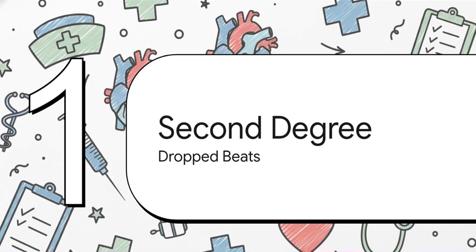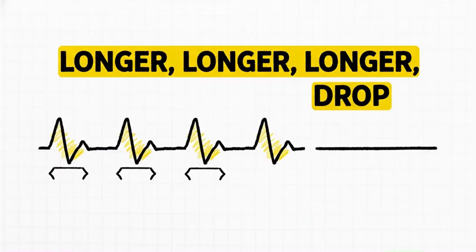Now, this is where things start to get a little more serious. Remember our AV node gatekeeper? Well, now it's starting to slam the gate shut on some of those signals, and that means we're going to start seeing some dropped QRS complexes. So the first type of second degree is called type I, or you might know it as Wenckebach. The classic pattern here, and I want you to remember this, is longer, longer, longer, drop. The PR interval literally gets a little bit longer with each beat, until, bam, a beat is dropped entirely. You'll see a lonely P wave with no QRS after it. Then the whole cycle just starts over again.